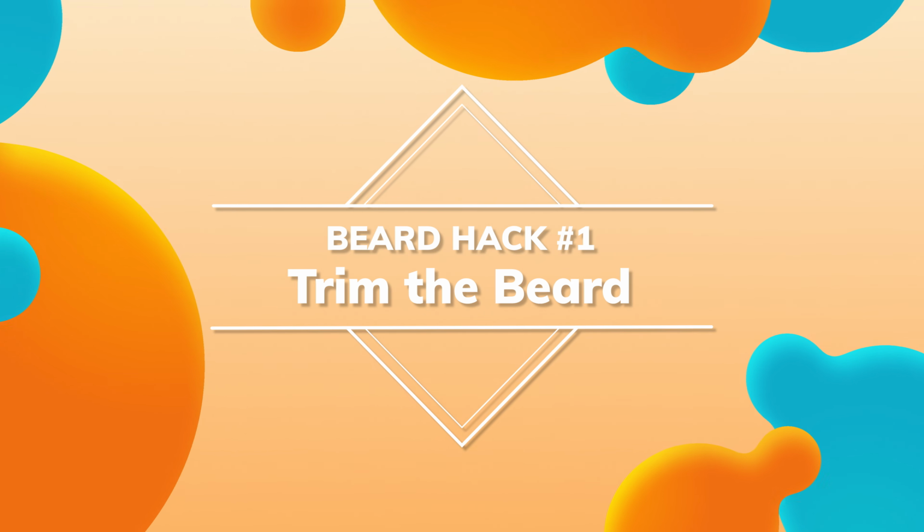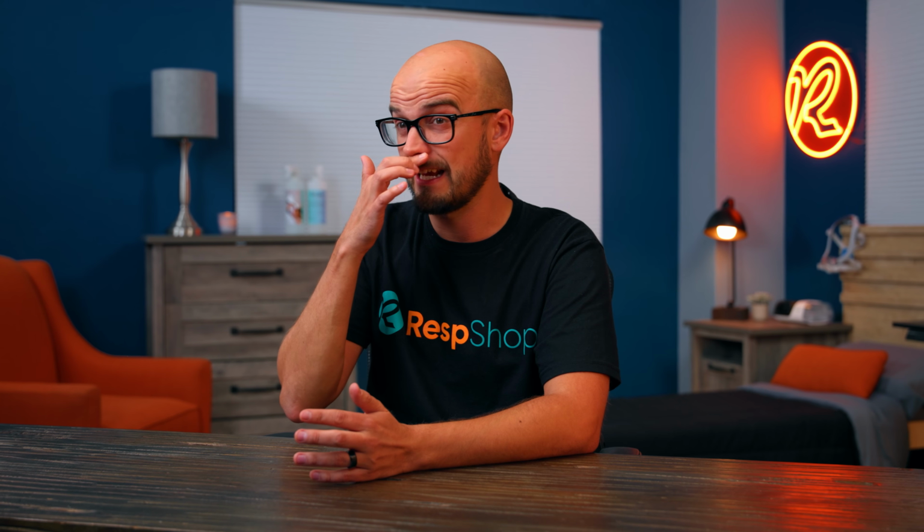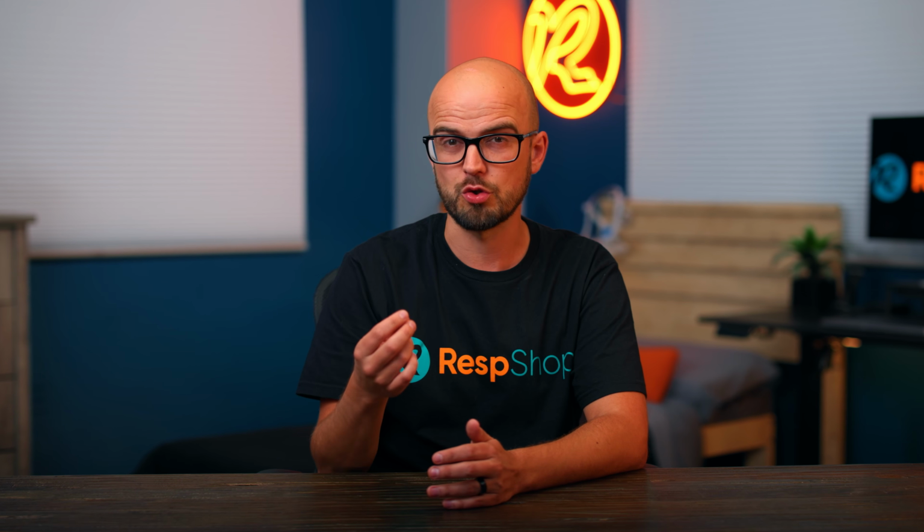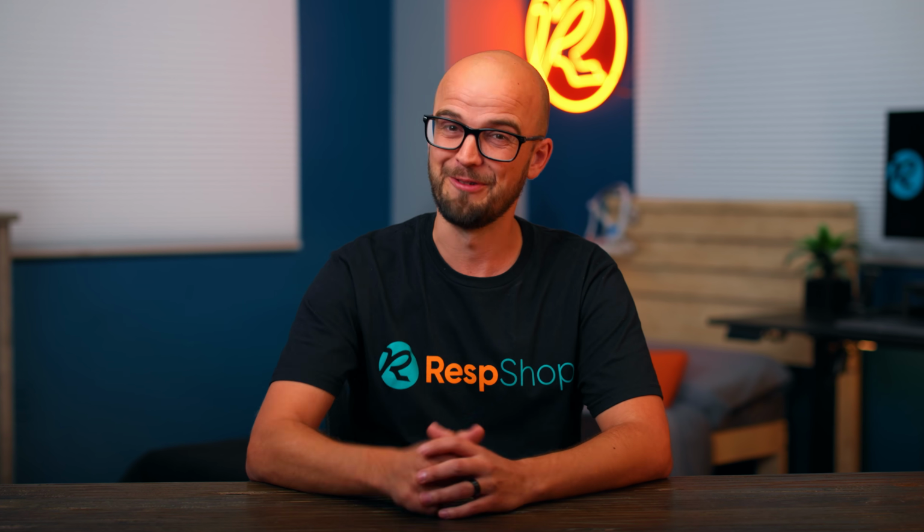Hack 1. You don't need to shave off your facial hair, but if you have a nasal mask that seals against the skin just under your nostrils, a slight trim of the hairs right under your nose where the cushion sits can make a big difference. Trim just enough to allow the cushion to touch your skin without reducing the size of that impressive lip fur. We know you love it.